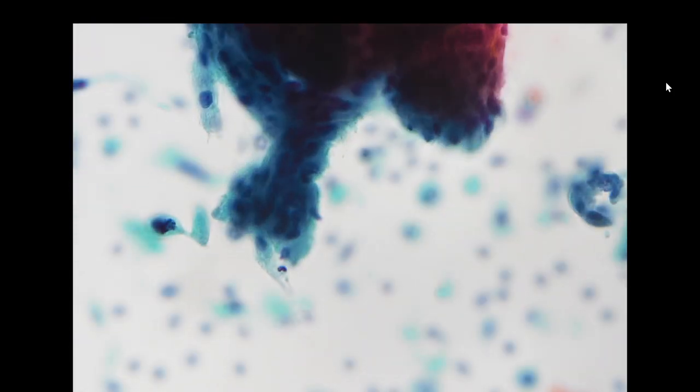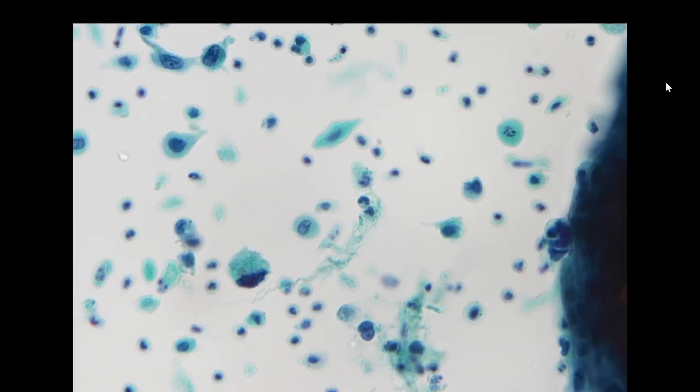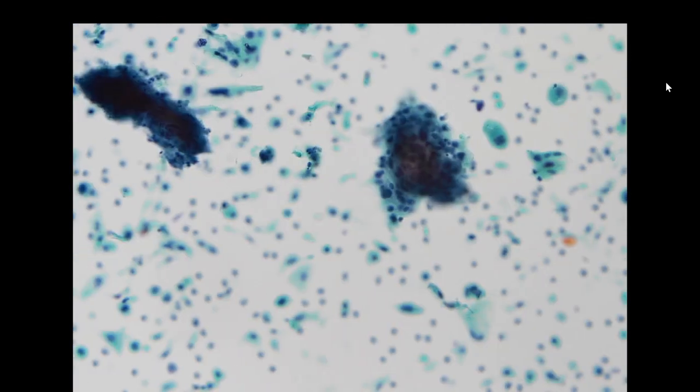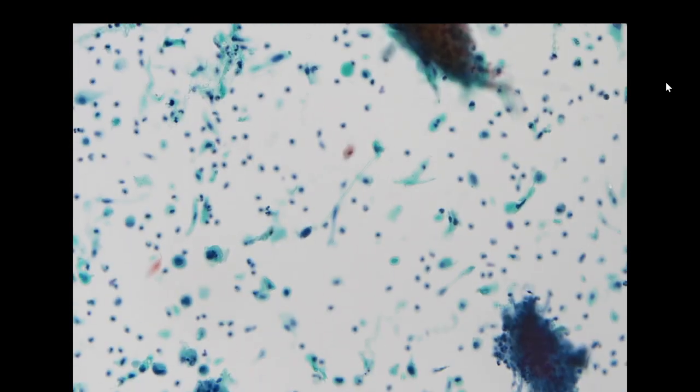If we suspect squamous cell carcinoma, we want to look for well-preserved, more parabasal or lower level cells. So I think this is a good example. Here we have maturation, and then here we have the basal part. All the cells look very hyperchromatic with high N/C ratio. And in the background, we do see tumor necrosis. So this is diagnostic for squamous cell carcinoma. The parotid is not a location for primary squamous cell carcinoma, so the majority of the time, this is coming from metastasis of a primary head and neck squamous cell carcinoma.